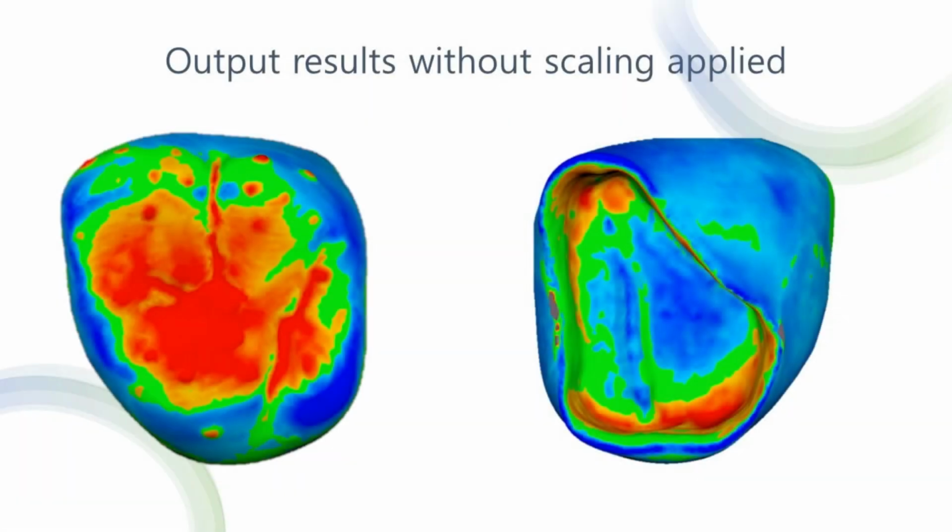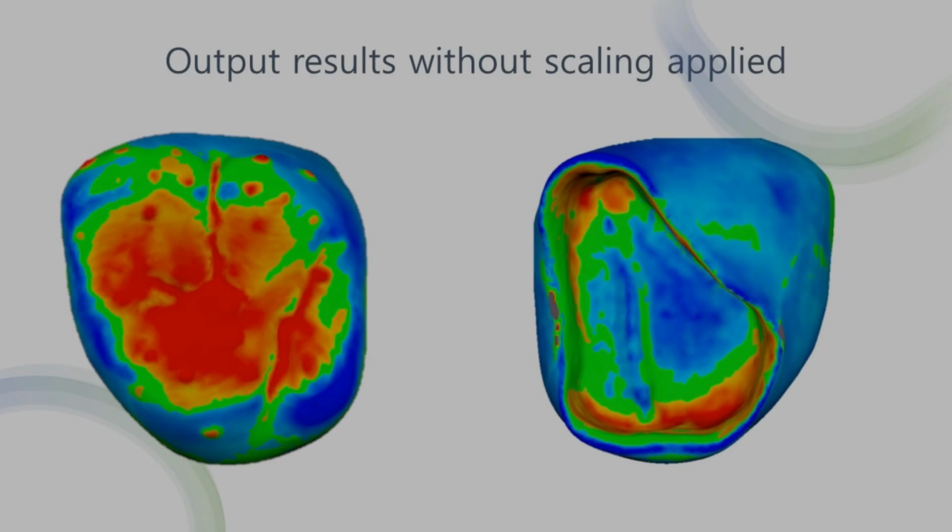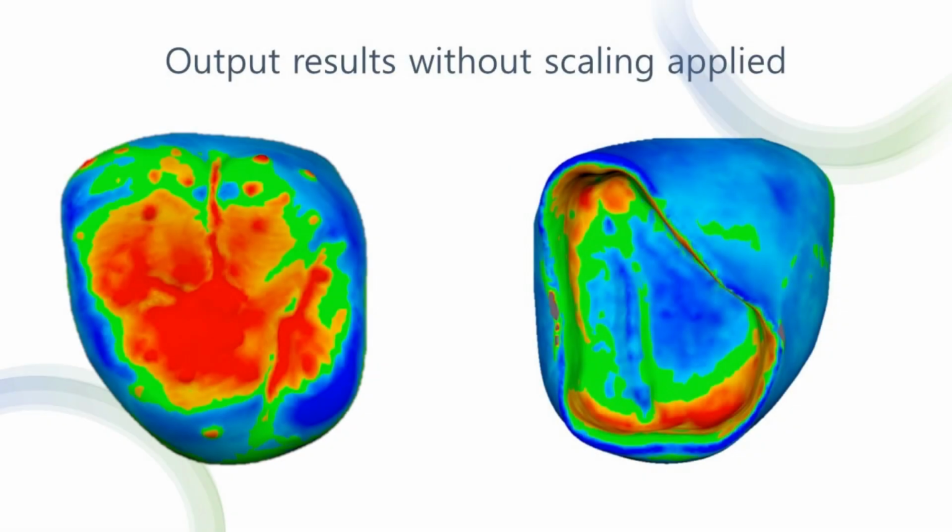Comparing the scanned data of the crown with the original design, significant discrepancies were noted, particularly in the interior, exterior, and occlusal surfaces. For the crown's interior, we observed a narrowing result due to polymerization shrinkage, which deviates from the original design.